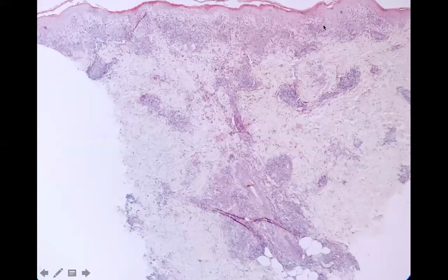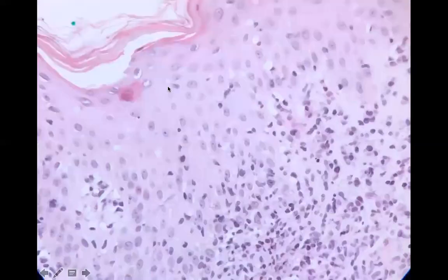Here's another case where you don't have a large eschar, but you still have this superficial and deep infiltrate with some vasculitis. There's a little bit of an interface here. Sometimes that's a clue. Sometimes you'll see these elongated cells that at one point I thought were activated lymphocytes, but at some point I've decided that they may not be, and I've talked to experts such as Dr. Phil Lebois, who's named them twistiocytes. So from here on out, I'm going to refer to them as twistiocytes, and maybe they're dermal dendritic cells. Nobody knows exactly what their cell of origin is, but we tend to see them in infectious processes.